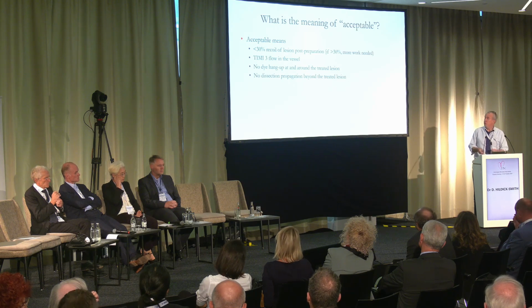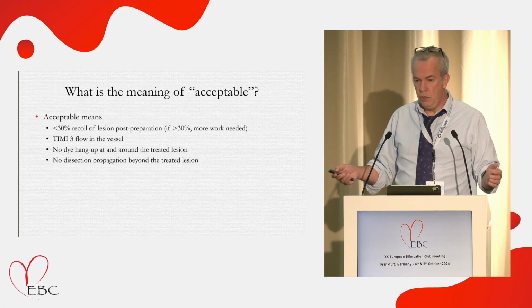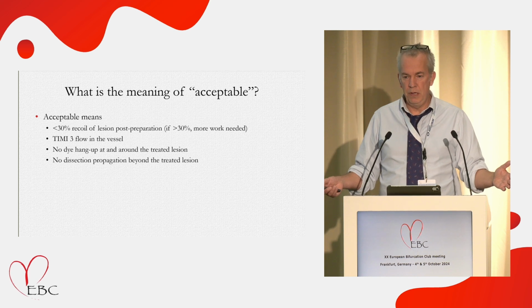At this stage at least, those are the definitions, and the guys will be able to tell us whether this is what they see as the correct definitions. And then all follow-up after that is clinical. It's outcomes based on numbers, really. Do the patients do well? Do they get any recurrent angina? Do they come back with hard clinical events?